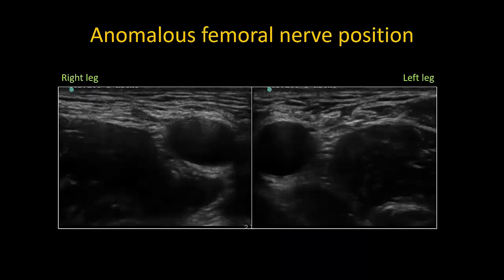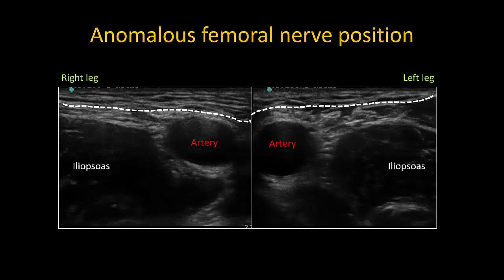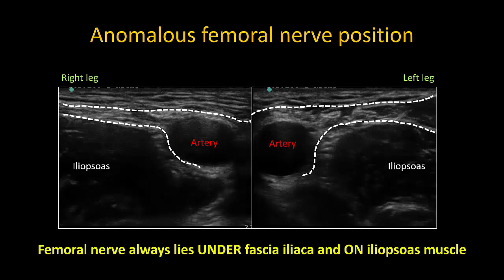Here is a prime example of this phenomenon. In this individual, the femoral nerve is not immediately obvious. The femoral artery is identified, as is the dark hypoechoic iliopsoas muscle, which is more of a rectangular rather than triangular shape here. The fascia latae and iliaca are also readily identified, and knowing that the nerve lies under fascia iliaca and on top of iliopsoas, it becomes clear that the femoral nerve is the structure immediately next to the artery and even partially under it on the right leg in this individual.